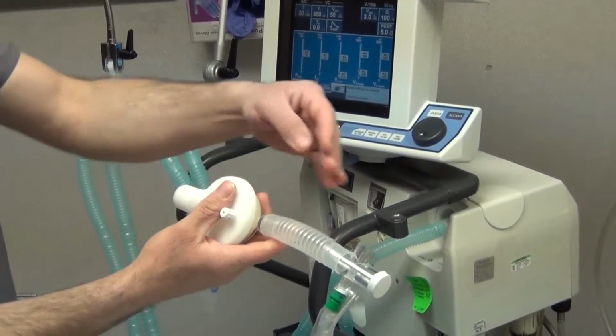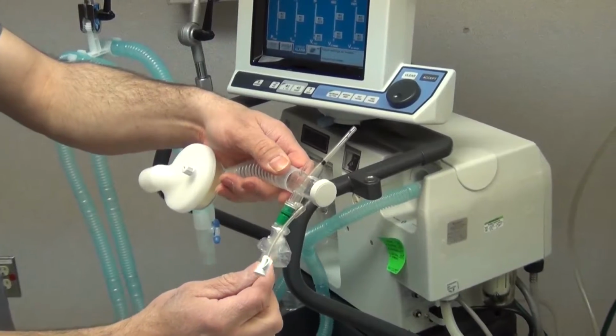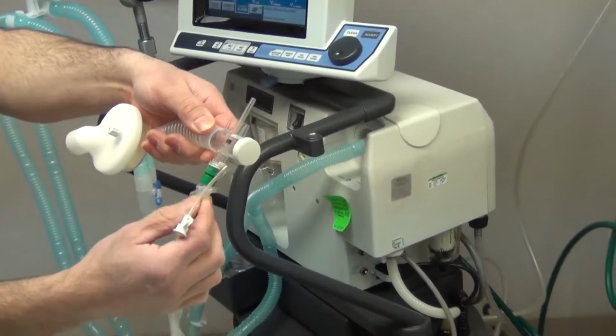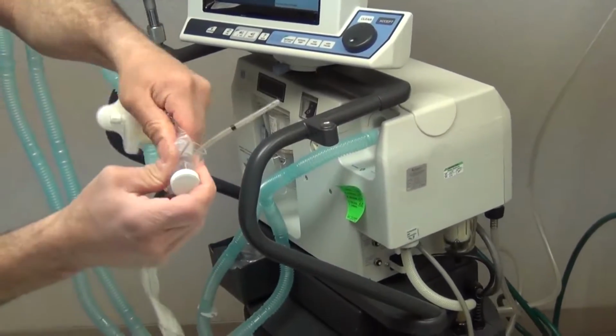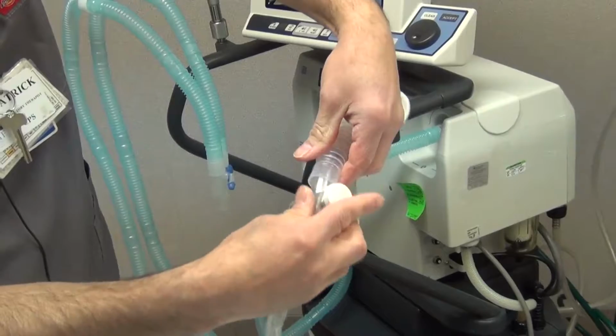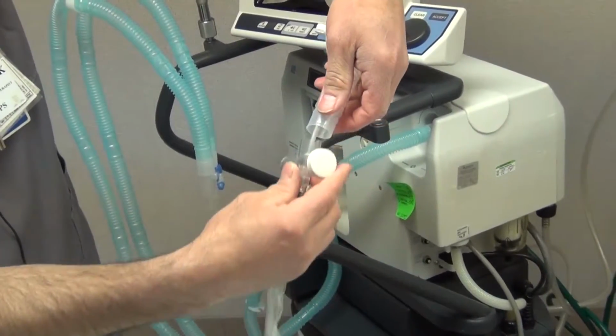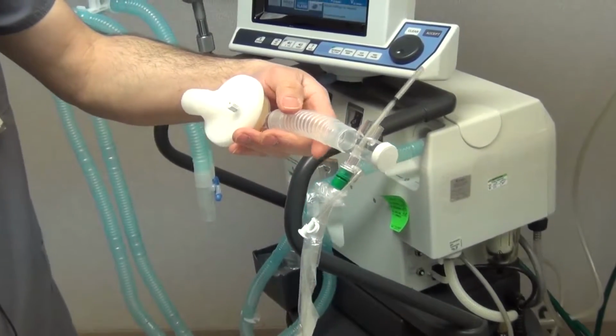Notice that I have the Ballard. It's a T-piece. There's a suction. The suction goes into the patient's ET tube, so you can't make a mistake. If you were to put this over here, you know that would be wrong, because first of all, it doesn't fit, and also you don't suction where that is. So you know how to set it up like this.